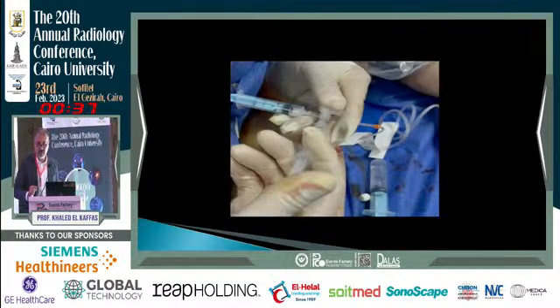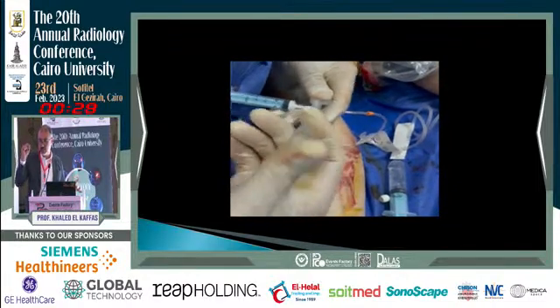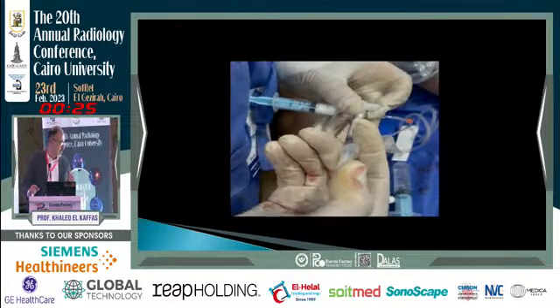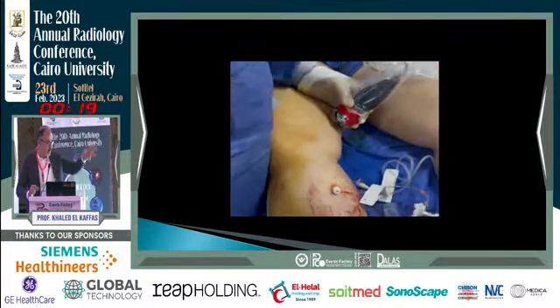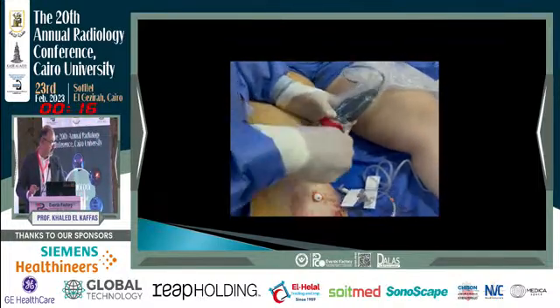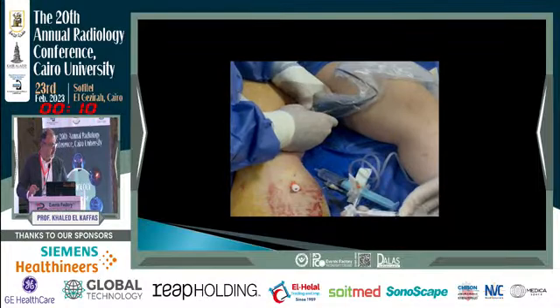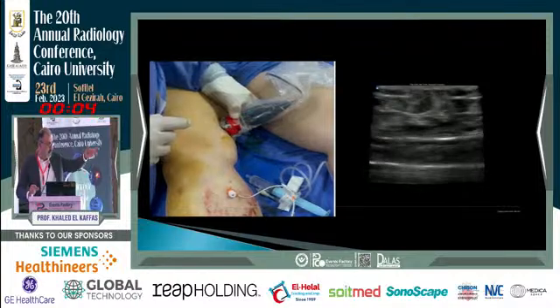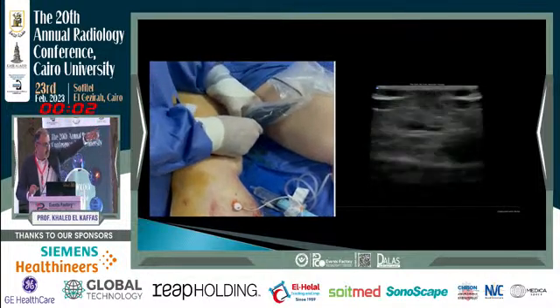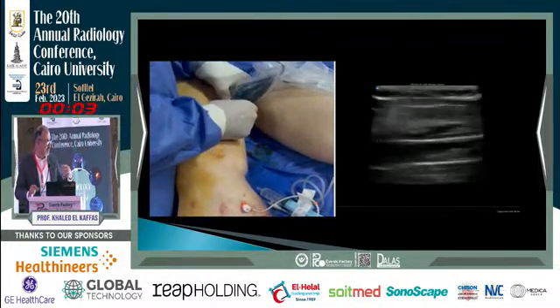Here's the technique I have recently adopted, injecting the foam through the introducing sheaths. After applying tumescent anesthesia, which compresses the vein to reduce its size, I prepare the foam and start injecting it inside the sheaths. Now you can see the propagation of the foam inside the vein in the ultrasound image. We inject segment by segment. The nice thing in this picture is that the foam runs in the tributaries, as you can see at the top of the picture. So we obliterate the tributaries also, not just the saphenous vein. We fill the saphenous vein with foam.